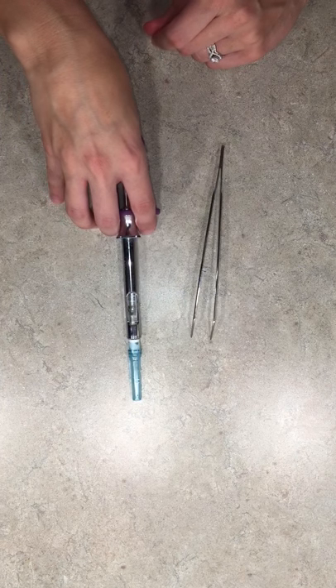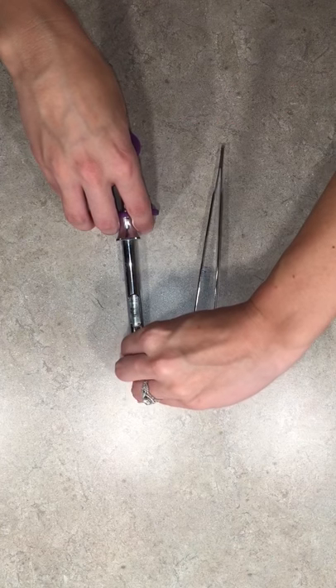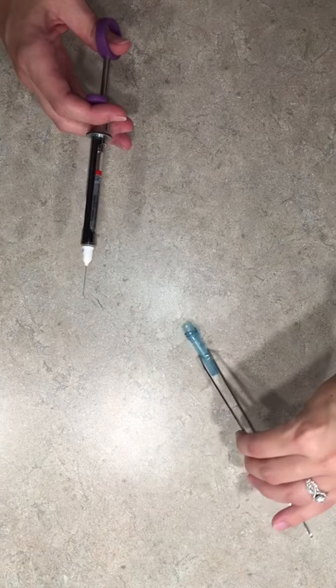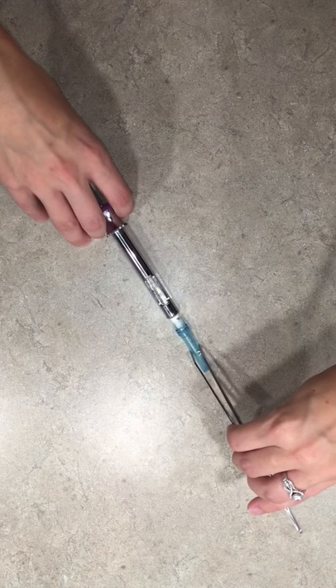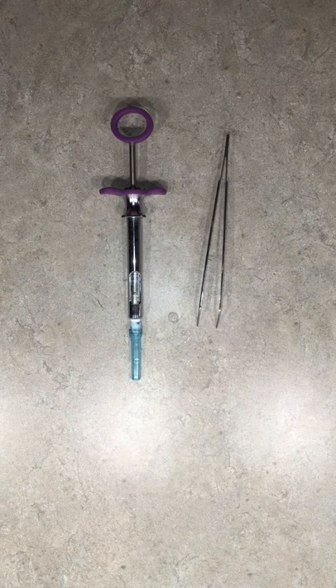We can set that down. If your needle is not cooperating with the needle sheath, what you are able to do is use your cotton pliers as a guide to hold that sheath into place — like so. And that is the one-handed scoop technique.